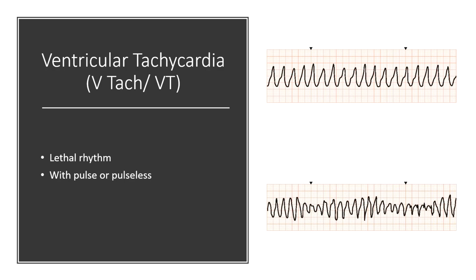Patients might have a pulse for a little bit. So you always want to check a pulse if you see VTAC on the monitor. And then you want to assess your patient. So if this is left untreated, this will cause your patient to pass away. And then significant reduction in the cardiac output, the blood that's being moved around when we have this really fast rhythm. This can be caused by lots of different things.